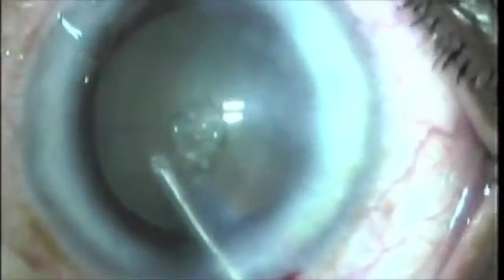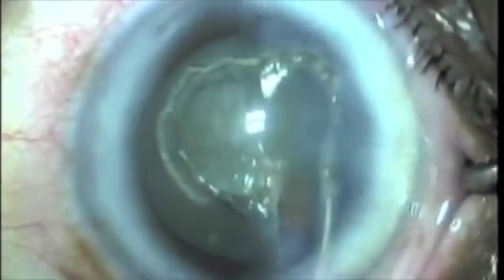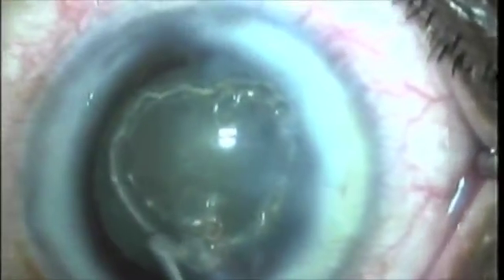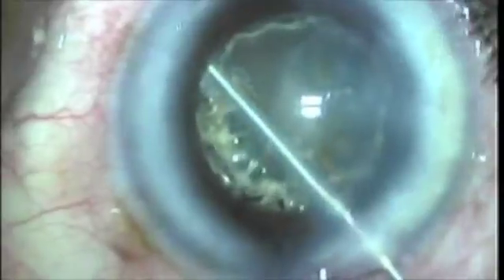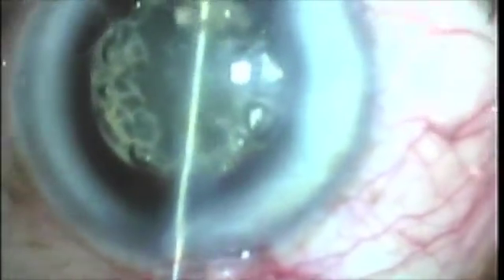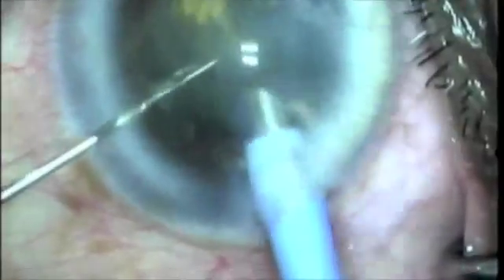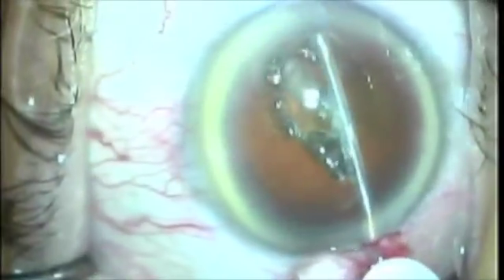Now I'm going to continue on, and I'm comfortable because if you ablate in front of a tear in the capsule, you have effectively stopped it — the tear will tear into the Fugoblade ablation path. I proceed ahead with this tear patient the same way as the prior two cases. Here is my black female patient who came back, ecstatic with the results of her first right eye — the Saltzman nodular patient. We go in to the left eye. My scrub nurse was yelling that she couldn't see, and I was saying back to her that I can't see either. So you don't have to have great visualization with the Fugoblade — that's one of the advantages. I impaled it, pulled it up into the iris plane, did a FACO flip, cracked it, and in this eye she ended up with about a sloppy 20/80 vision. This woman was extremely happy.